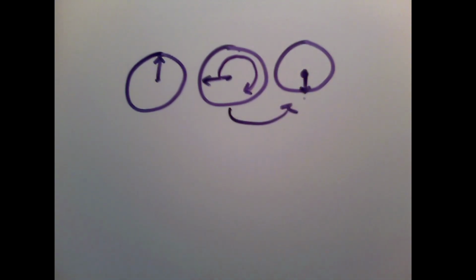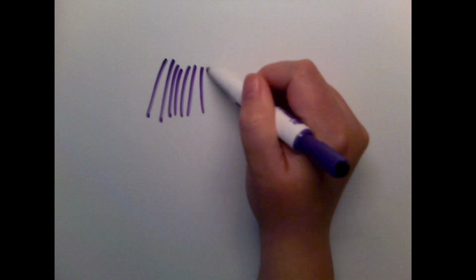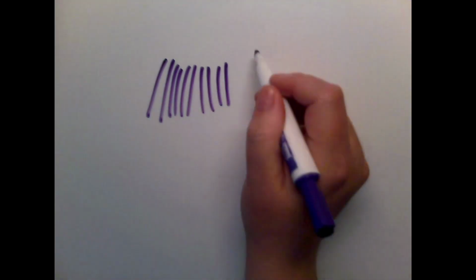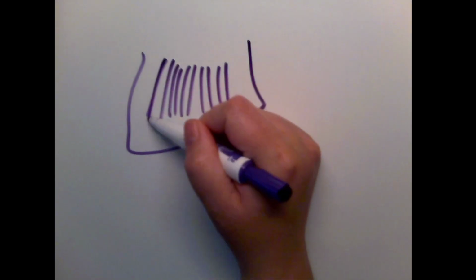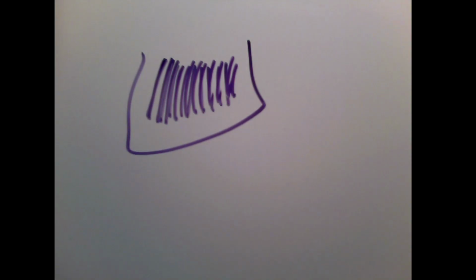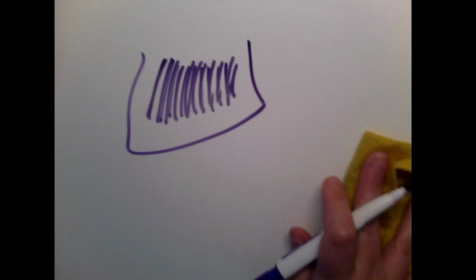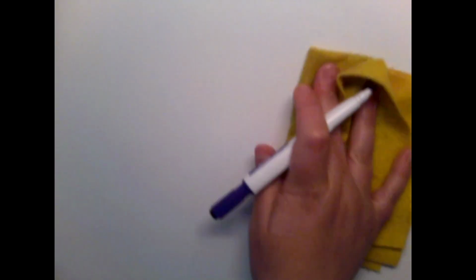And so that's kind of what's happening in our ultrasound machines. The eyes are shut, or the machine's eyes are shut, while all of those beams are being created and then made into our final picture. If the eyes have to be shut or the beams take a long time to make, we're going to miss some of the movement of the structures that we're looking at. So again, we're going to talk about what causes our eyes to be shut or what causes the beam to take longer to make in this lecture. So you want to be very familiar with those.